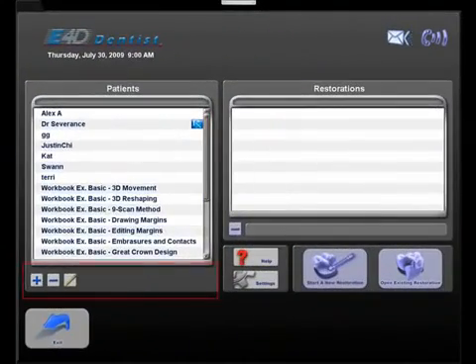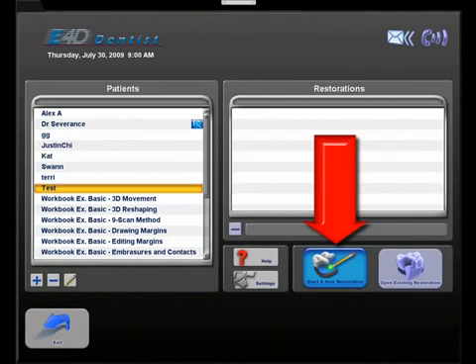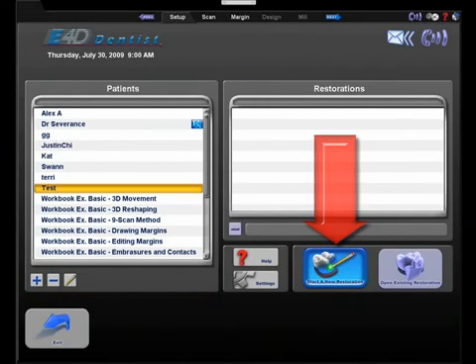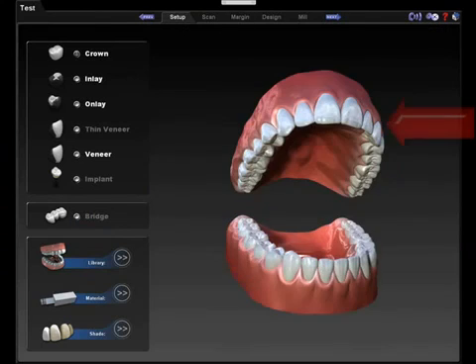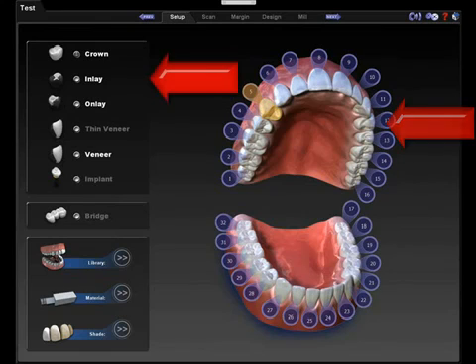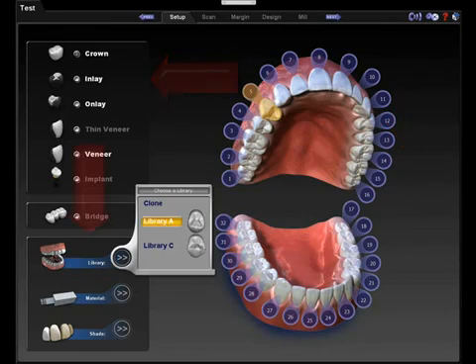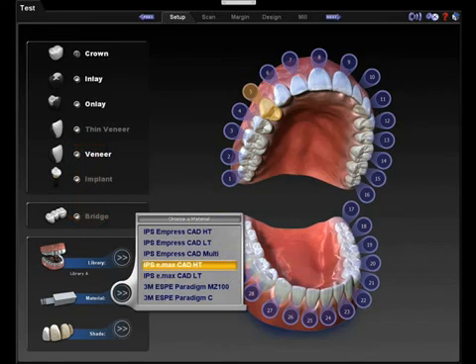The first thing is on the setup page we create a patient. Then we click start new restoration. You select the tooth number, the restoration type, the library, material, and shade.